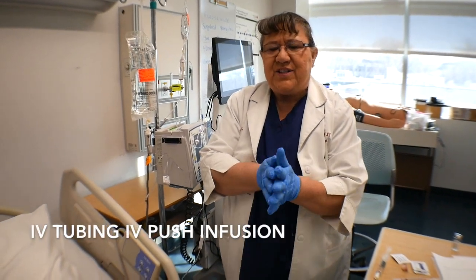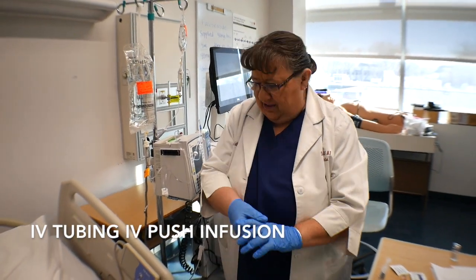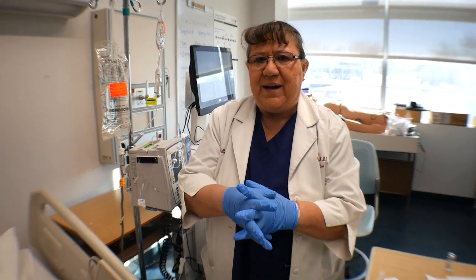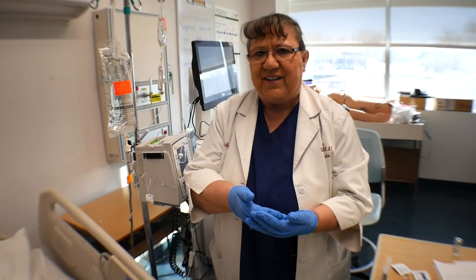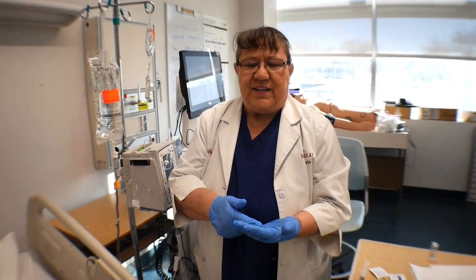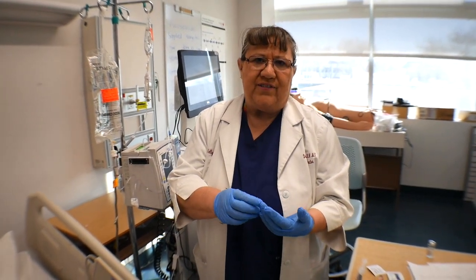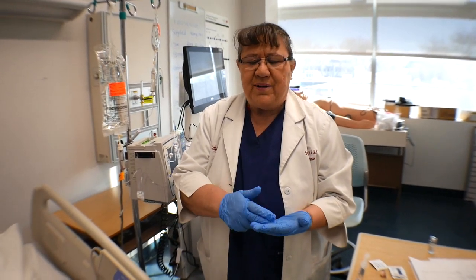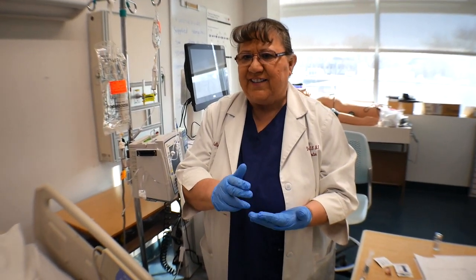Okay, now I'm going to demonstrate giving famotidine through the IV tubing. So I've already calculated out my medication, looked up my medicine, determined how long it needs to be given. It needs to be given over 2 minutes, and I have a total of 8 milliliters. So it turns out that I will be giving 1 milliliter per every 15 seconds.